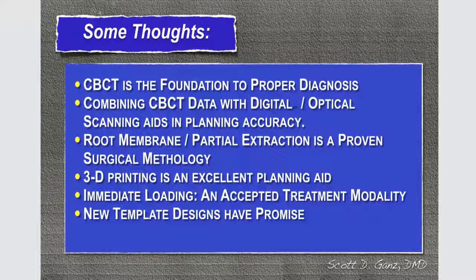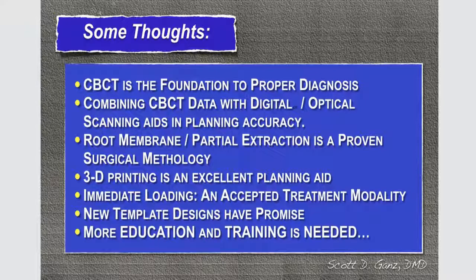New template designs, like you saw, the scallop design, the stackable designs, and many others. We use 3D printing to create sinus augmentation guides, sinus lift guides, bone harvesting guides. All different types of guides are being created now. And there's so many innovative people out there that are doing this technology on a regular basis.